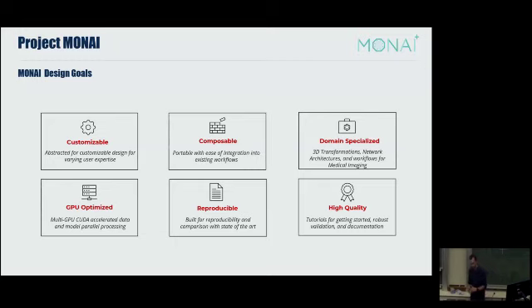As I say, we are working very closely with NVIDIA. They are making a substantial effort towards MONAI. This is great. That means that we've got dedicated developers looking at the most complicated part of the software development, which we barely touch on as users. The MONAI code is optimized to run on multiple GPUs.